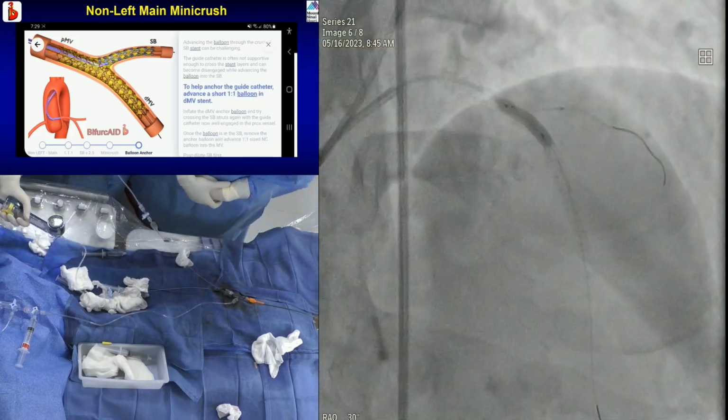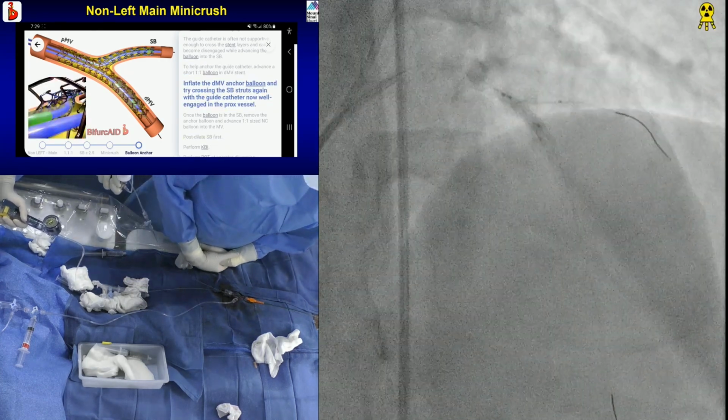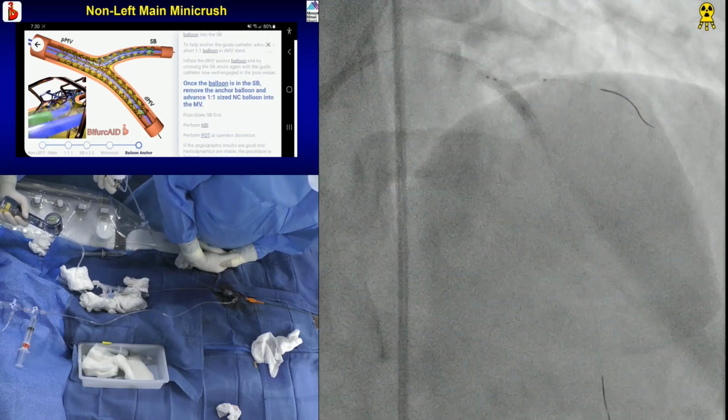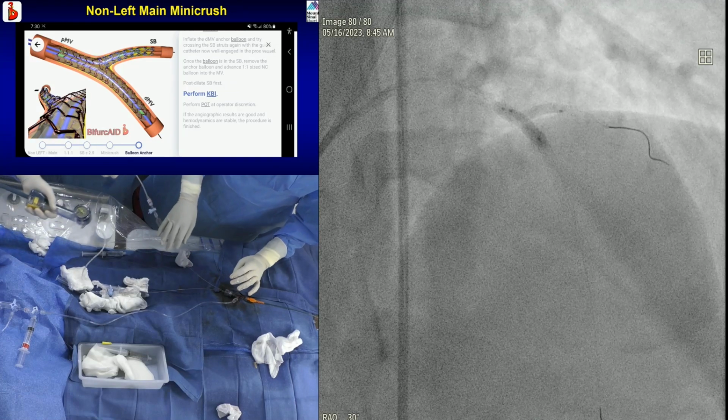Yeah, happy? Yes. Both 12. Yes. And then I'm going to do left main and then IVUS. 4.0, yep, left main. Good. Okay. You can use down both of them simultaneously. They will be the same.